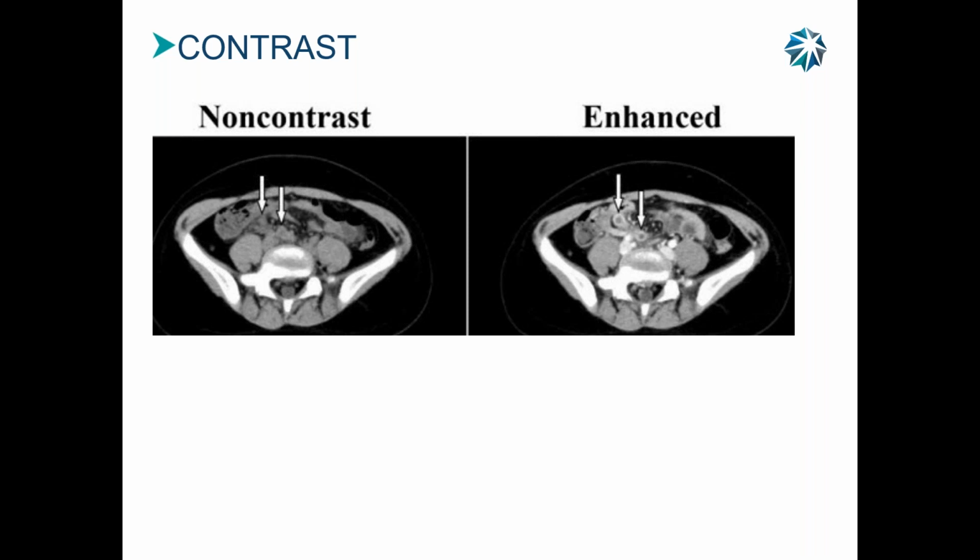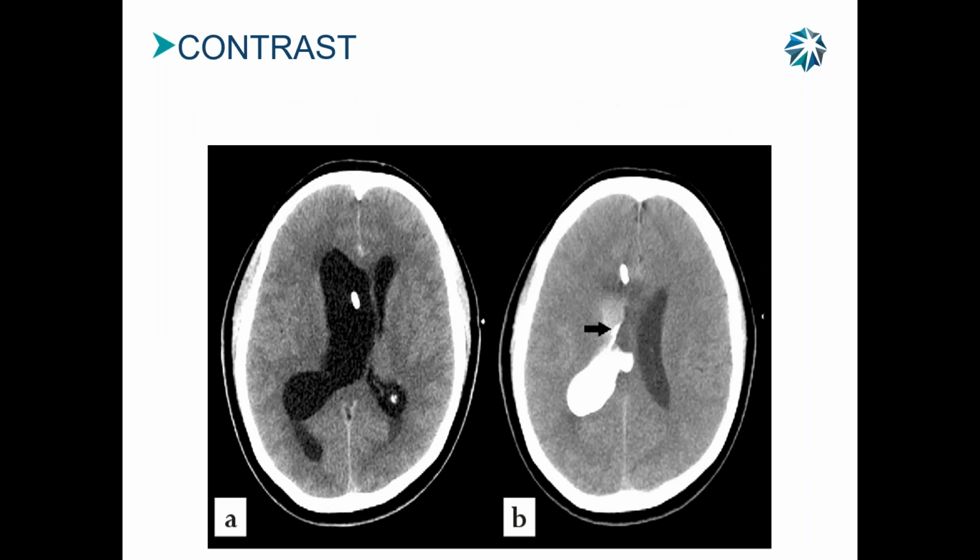These images aren't that exciting, are they? It really doesn't give you a, wow, this is really some neat stuff, right? Okay, here's another one, with and without. This enhances this area and shows up white because it blocks X-ray.